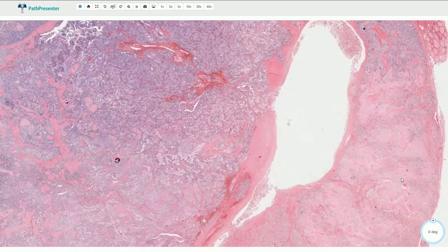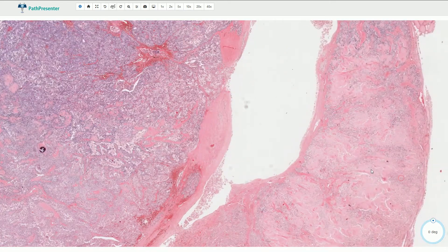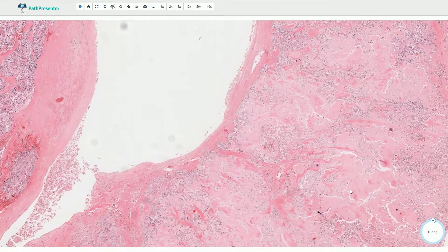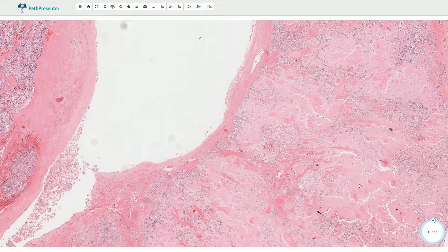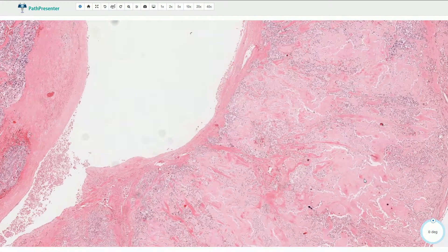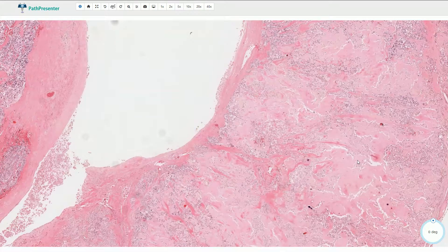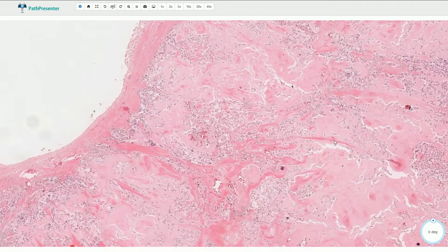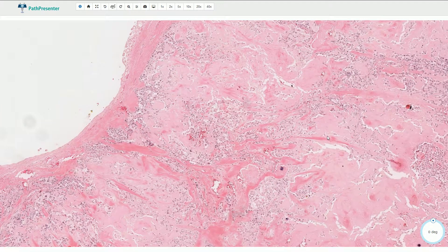Here we have very prominent deposition of amorphous hyalinized pink material, and this is amyloid. It would show positivity for Congo red and apple green birefringence in polarized light. Amyloid deposition is probably the most useful clue in diagnosing medullary carcinoma; however, it is not present in all cases.